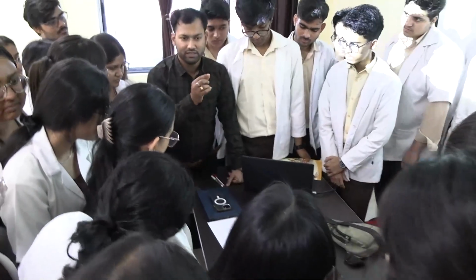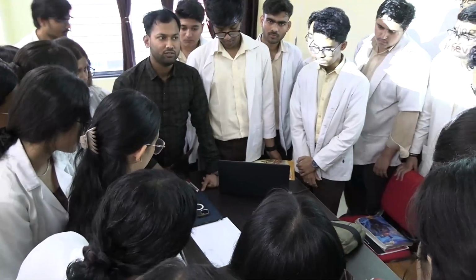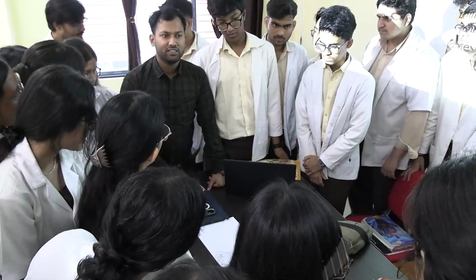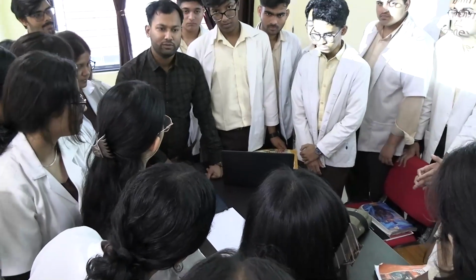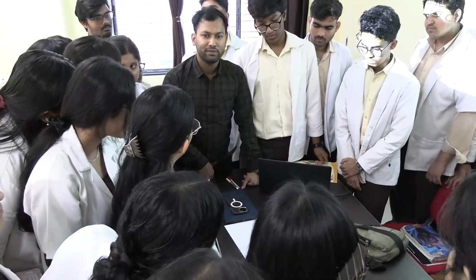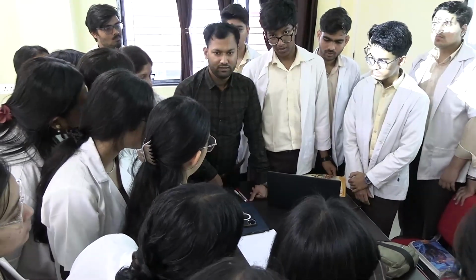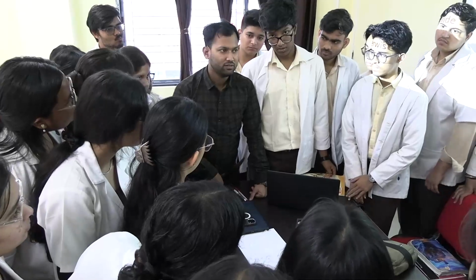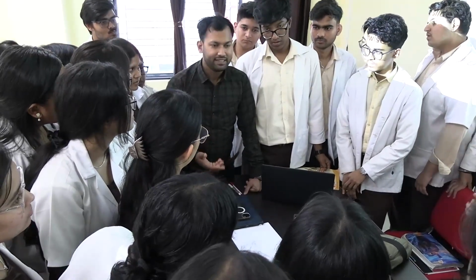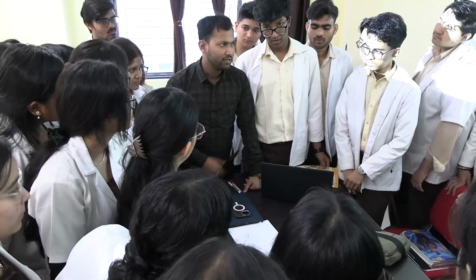I have shown you a picture. There are dot-like things. So this clump formation will be there, and the specific clump formation will tell you about the blood group. If there is clump formation in anti-A, then what is the blood group? Anti-A is acting against blood group A, so obviously it will be A.